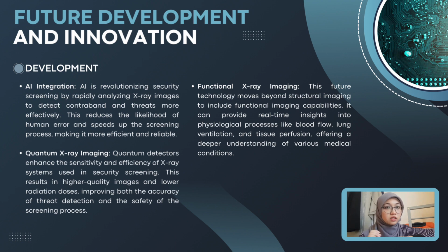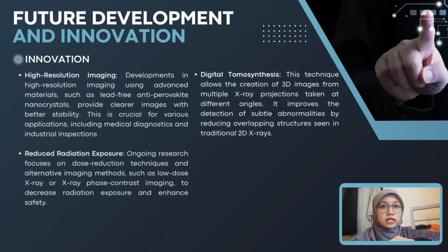And last but not least for this development feature is functional X-ray imaging. This future technology will move beyond structural imaging to include functional imaging capabilities, and it can also provide real-time insight into physiological processes like blood flow, lung ventilation, and tissue perfusion, offering a deeper understanding of various medical conditions.